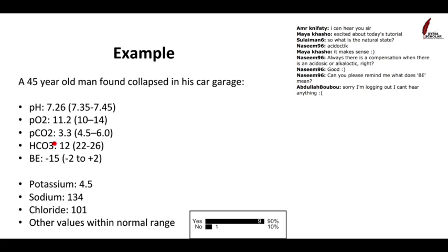So in our system, we've said the pH is acidotic. It's not explained by the CO2. It's explained by the bicarbonate. So this is a metabolic acidosis.